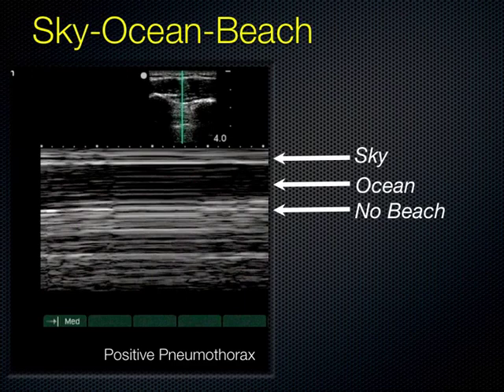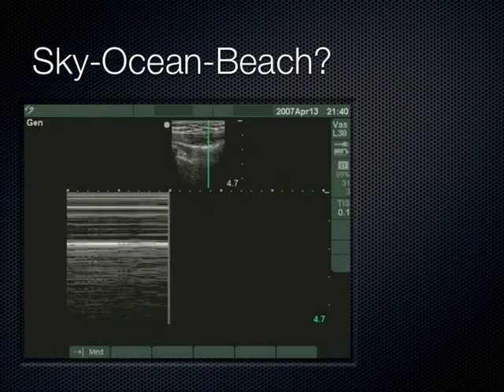Sky Ocean Beach. Nope, pneumothorax. Good job. Okay.